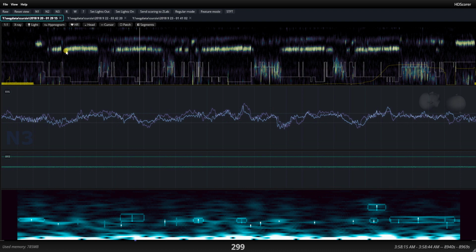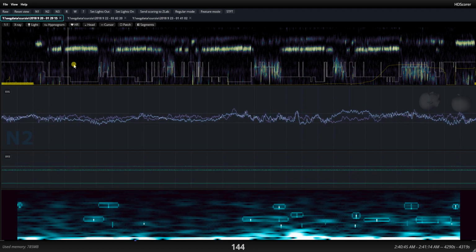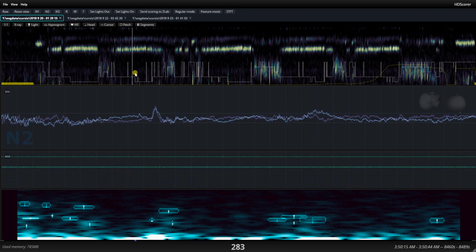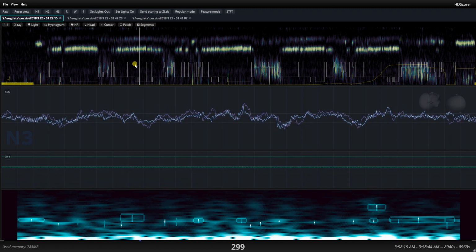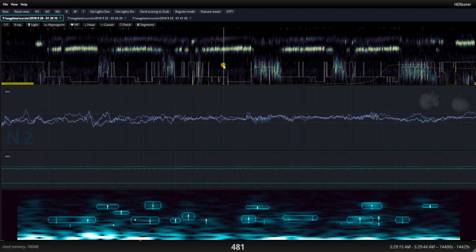In the first cycle you have a very fast descent, based on my research, from N2 activity to N3. That is, the delta waves kick in really fast, in a way where you can definitely tell where the threshold is at. From the second sleep cycle onwards, that appearance of delta waves is much more fluid and mild, so you don't expect to see such a threshold on the second sleep cycle, much less the third. You expect the transition to be much more gradual.